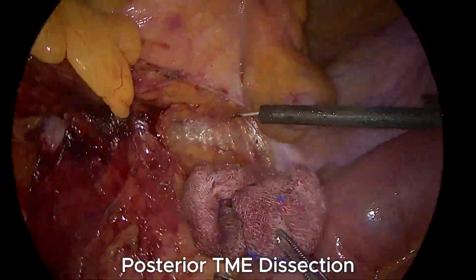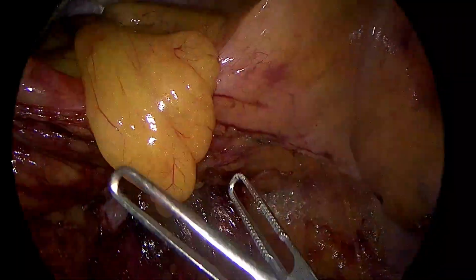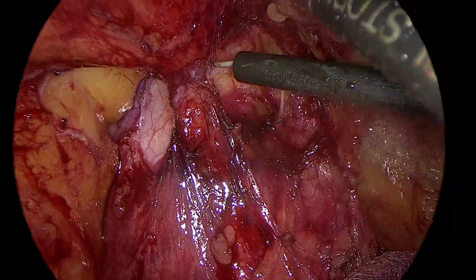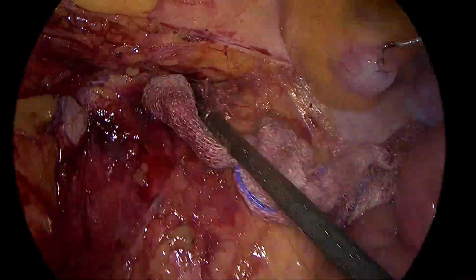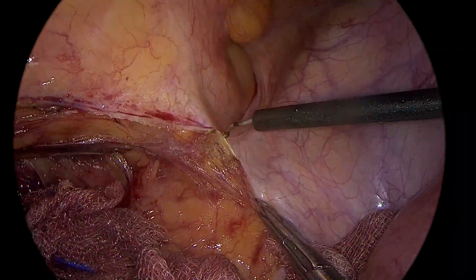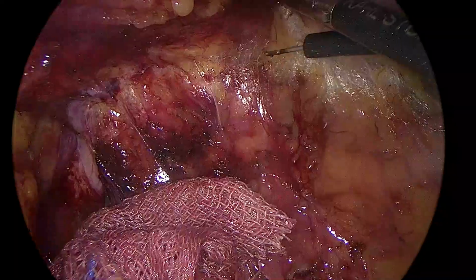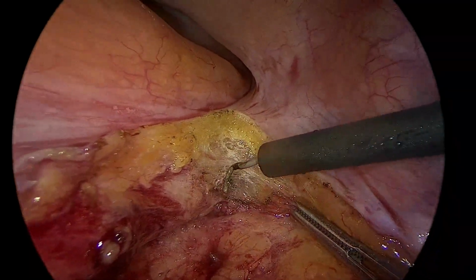Here we are doing the posterior TME dissection. Now moving on to the anterior TME dissection.